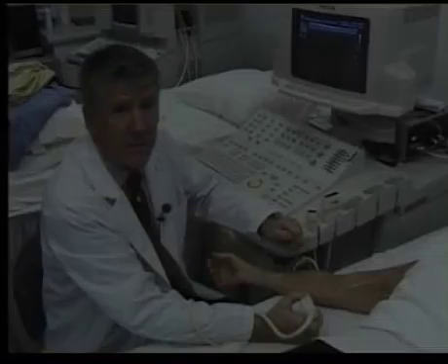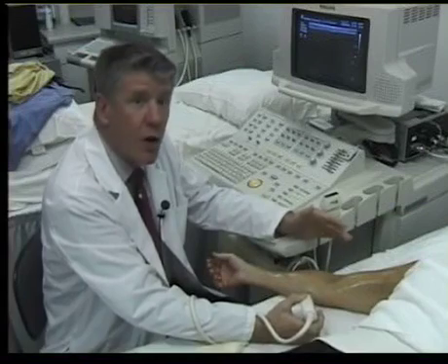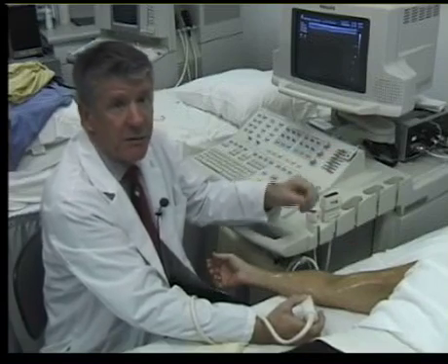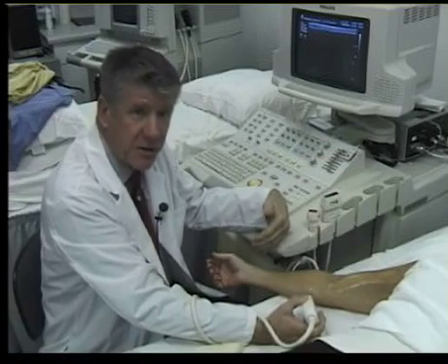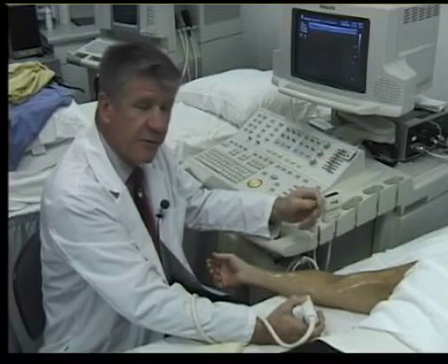Okay. Let's pause just for a moment and take a look at a live demonstration of the anatomy in the arm, the arteries and the veins. I'd like to demonstrate the normal anatomy. I'd like to start out in about the mid-upper arm, identify the brachial artery, the brachial veins and the basilic vein, and then scan more proximally, following the course of the vessels. Then I come back to mid-arm and follow them distally as well, all the way down into the forearm.